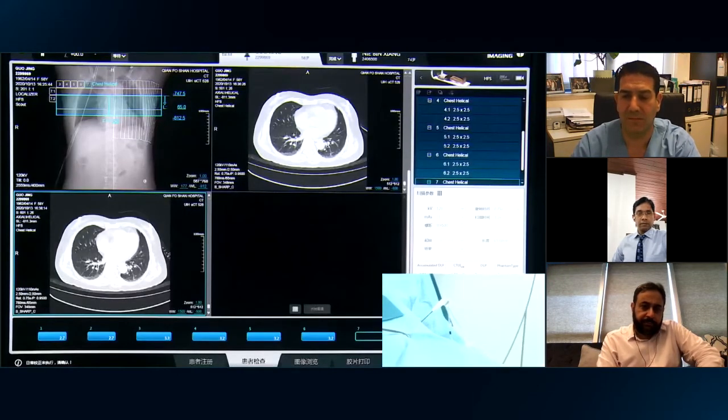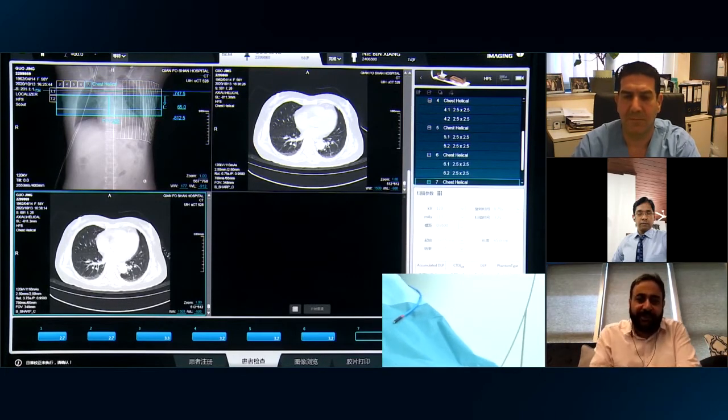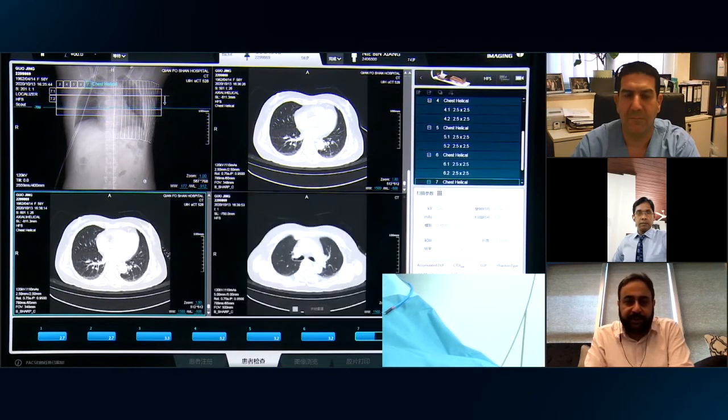I see that the professor also tried to go more anterior, to the anterior part of the chest wall, by moving the antenna a little bit anteriorly. I think probably he was just doing it because it is on the peripheral, the posterior and lateral margin.